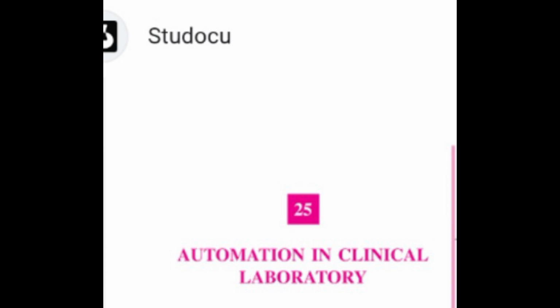In this competitive world, one has to improve the laboratory standard by concentrating on cost efficiency, time consumption, and accuracy of the laboratory reports. Before going to an automated laboratory, one has to work out the sample load, the time, and the type of tests one may get. Say, if the sample load is under 10, then it may not be advisable to go for the automated system in the beginning. If sample numbers exceed 30 per day, then they may pick installing a semi-automated auto analyzer in the laboratory.